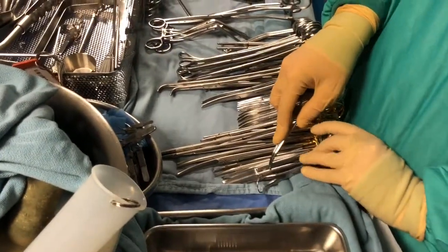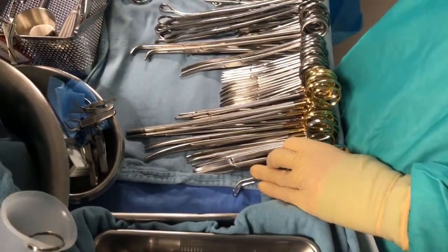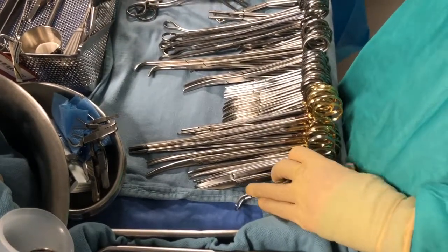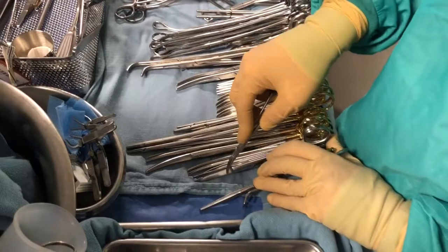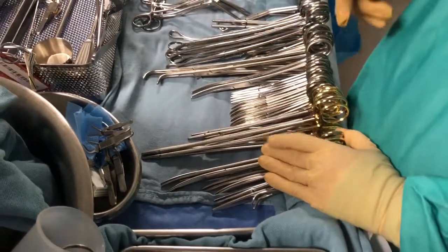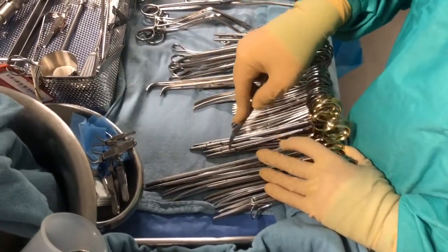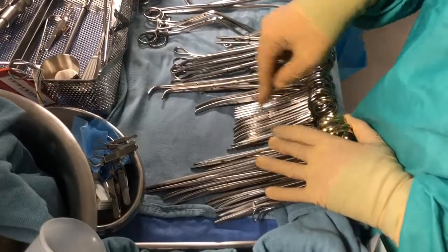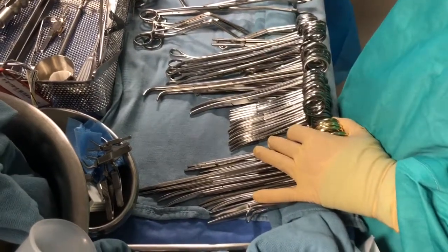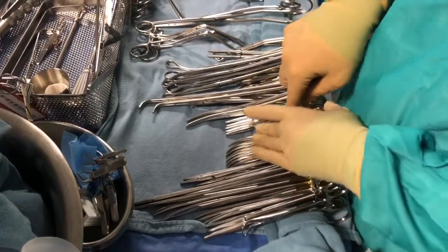Okay, so one towel clip, one. And as a circulator, you're going to be standing right there so that you can see my instruments and see me counting with them. Then scissors: 1, 2, 3, 4, 5, 6, 7, 8 scissors. Needle drivers: 1 through 9 needle drivers. Snaps: there's one in my hand, 2, 3, 4, 5, 6, 7, 8, 9, 10 snaps.